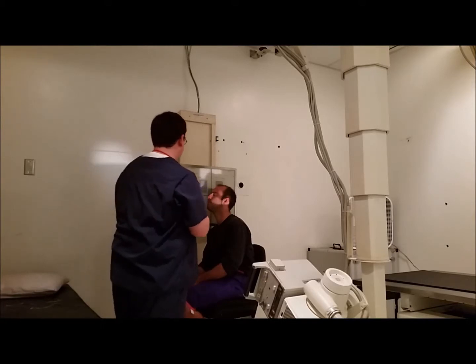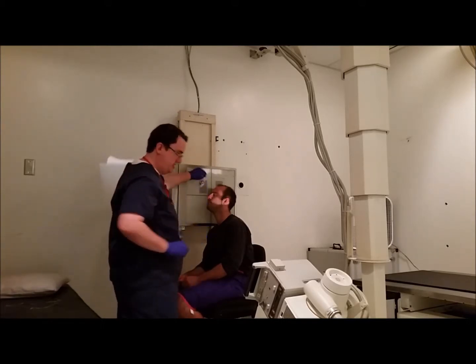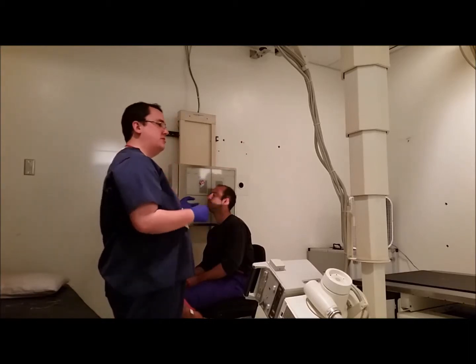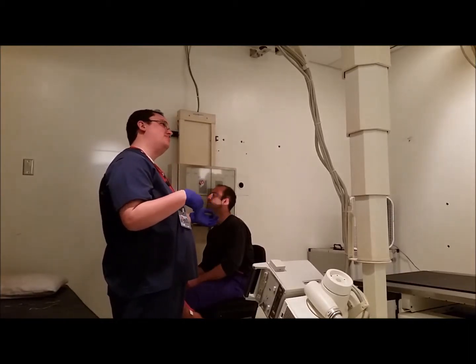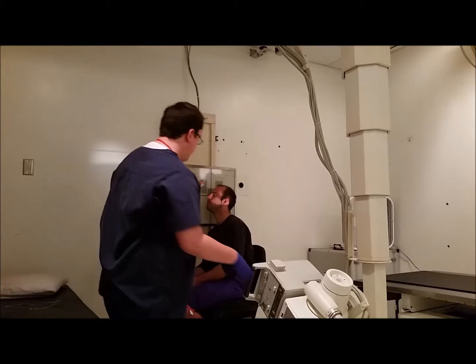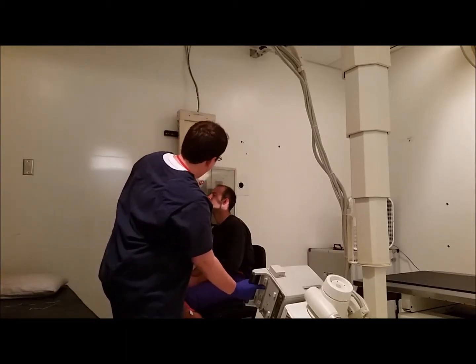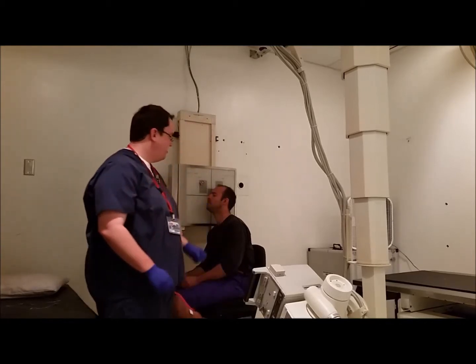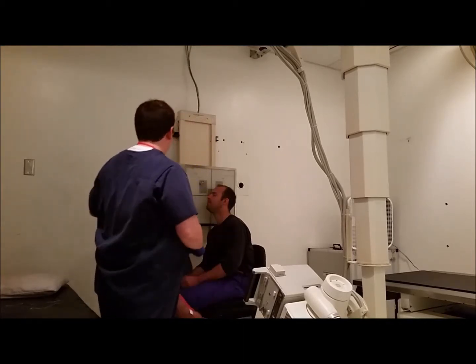All right, doing the right side here for this image. And once again, since it's a lateral, we want to drop down the technique a little bit. We'll do about 70 at 8 for this view here. There we go. All right, hold your breath, sir, and click. All right.